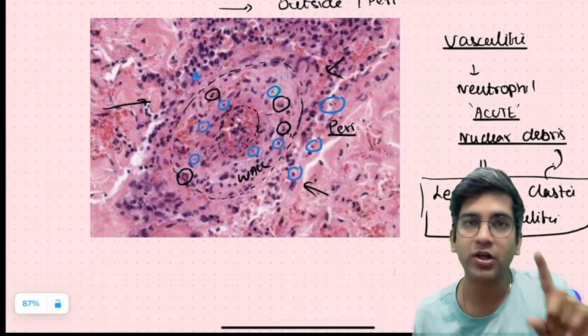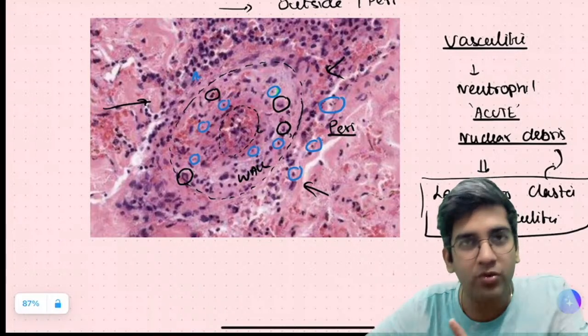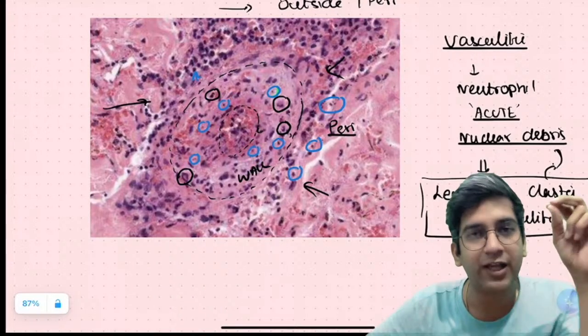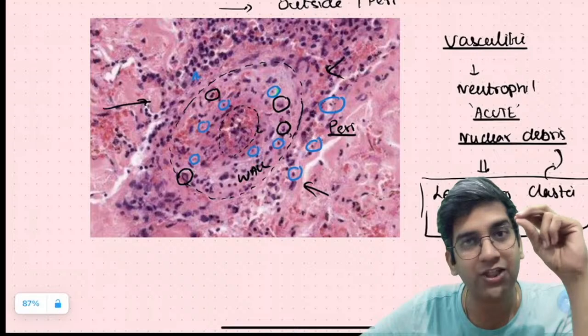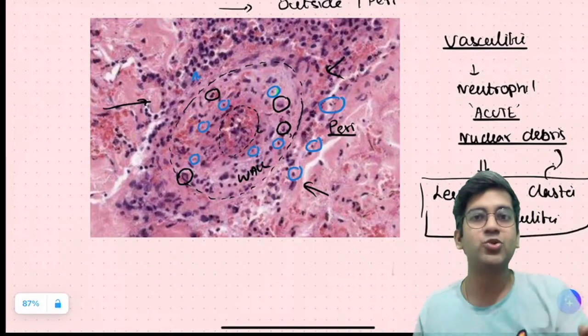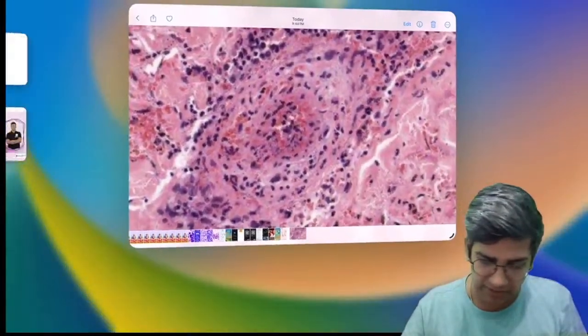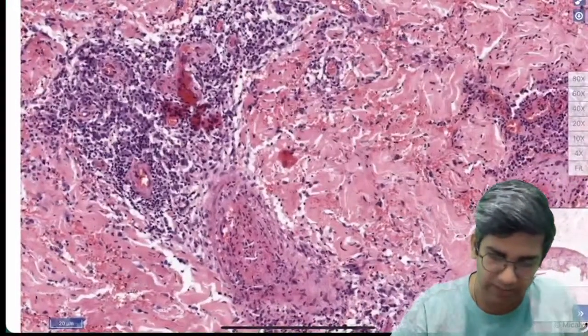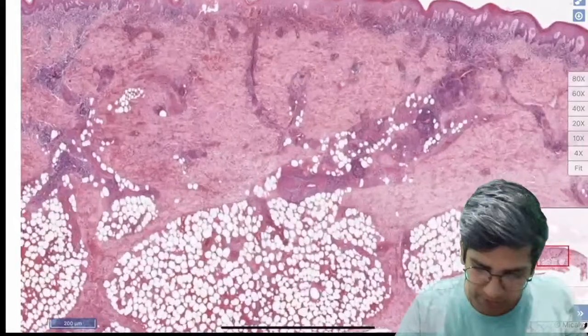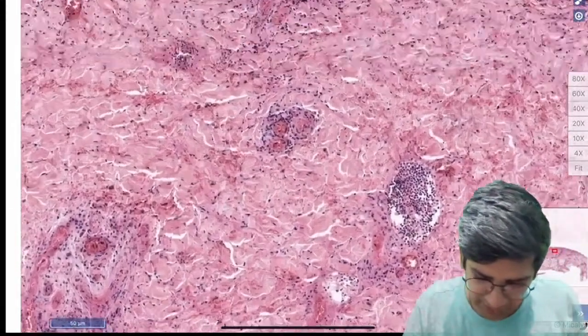We did agree upon it in one finding. Always make sure, keep this in mind throughout your career. Do not ever diagnose on one isolated finding. It should fit everywhere. Only when it fits throughout the slide could it be right. Or this finding could just be an incidental finding, in which we might go wrong at some point of time, right? Let's zoom in. Let's go and look at multiple other blood vessels. Am I seeing a similar finding? Okay.